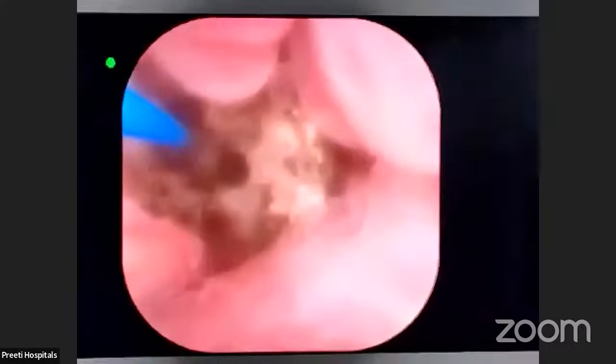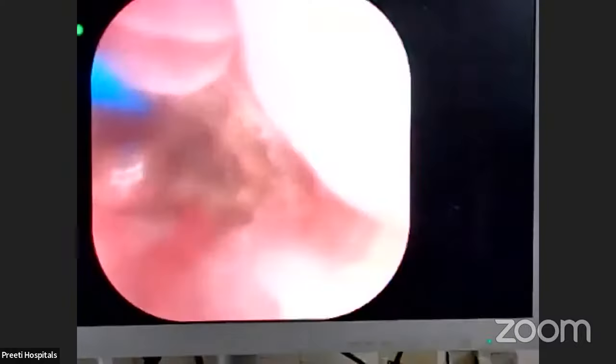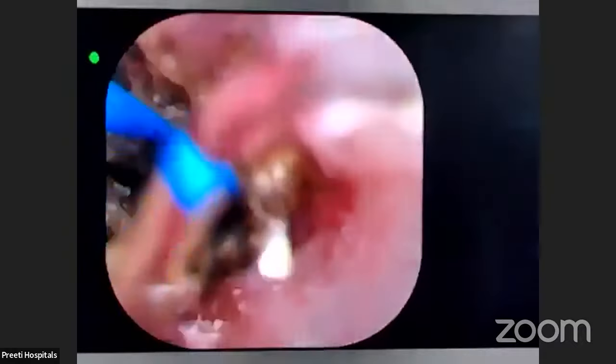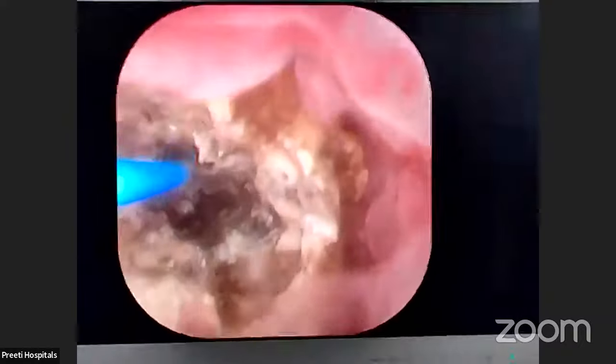See how it's sucking. See, if you don't do water inflow, suck it without water inflow, completely it sucks out. So every bacteria, see, it's just here. He's keeping here. But the only problem is movements will be little. Suck the air bubble also. You can suck the air bubble also. Boss, don't suck more. If you keep on sucking more, you cannot proceed with the surgery well.